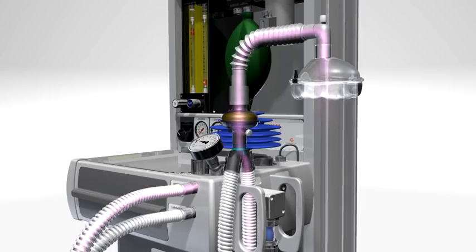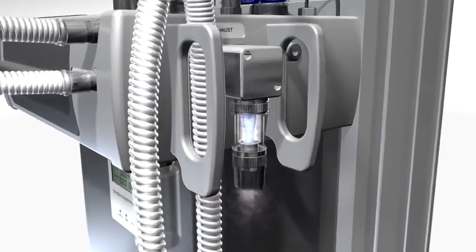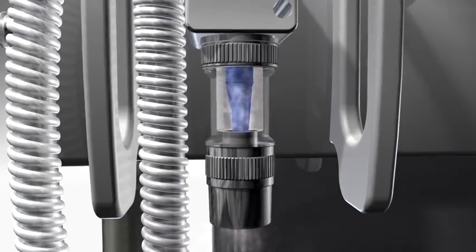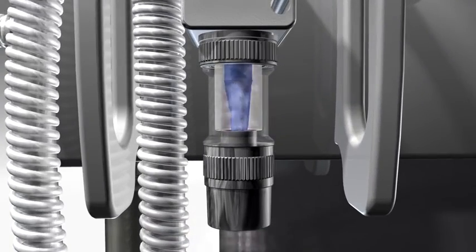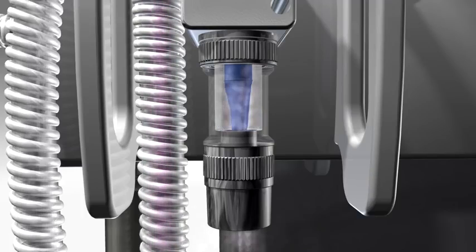The expiratory limb of the Y-piece channels gas to an inflating valve on the UAM that functions like an Ambu valve. It uses a balloon made from long-lasting silicone which closes during inspiration to direct gas into the lungs. During expiration, the balloon empties and opens the exit port, allowing exhaled breath to flow out through a final one-way valve to a scavenging device.